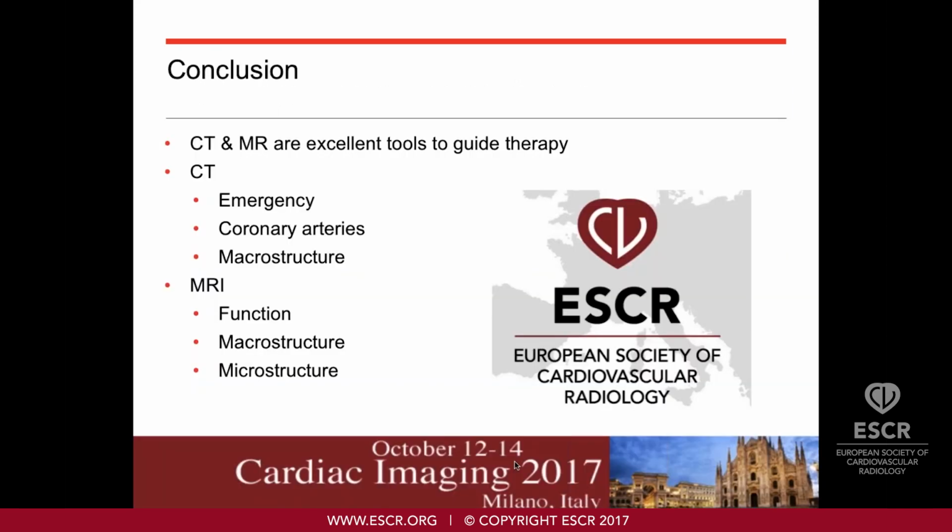There was, I think, a few months ago a fully dedicated webinar on mapping. Do you think it is the final solution to look behind the real conventional imaging? Or I was really attracted by the spectral CT images you showed, and the question is, what is their effective clinical utilization in practice? We don't have a spectral CT, but I think it might be interesting to look at iodine maps to characterize myocardial disease. So how to look behind T2 STIR and late enhancement imaging?